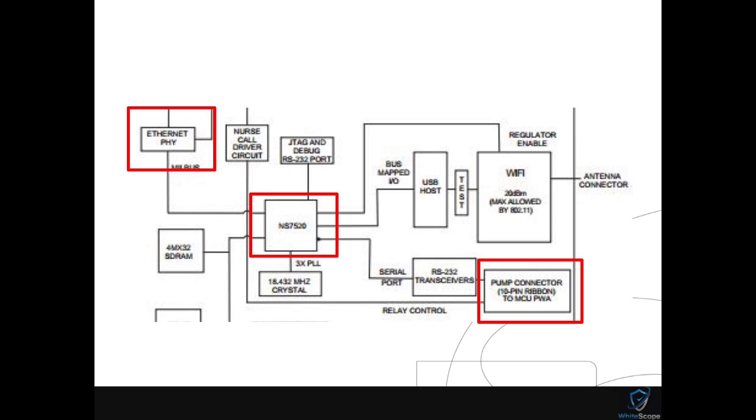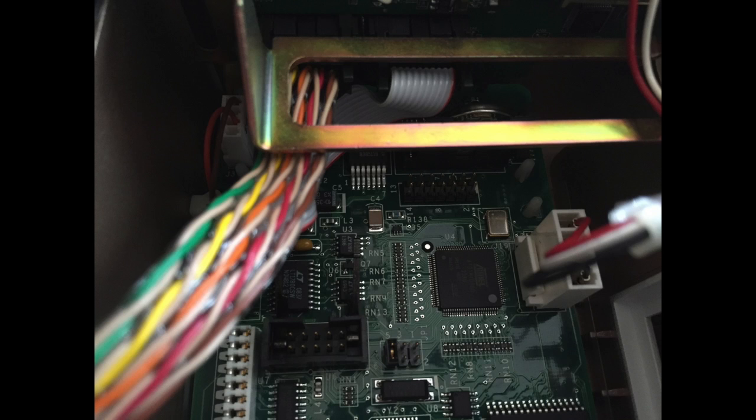Now, the way that they've done that is they separated this communications module basically via a serial port, RS-232, and we'll show you that in a second. When we look at how the communications module is connected to the main board, it's connected over serial. It's just straight RS-232 communications from the communications module to the main board. And if we look at how that looks in real life, you see this gray cable right there. That gray cable is coming off of the communications module and connecting into the main board, right? So that's a really good design.